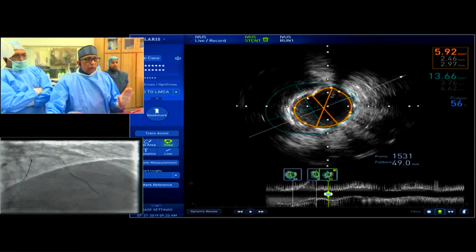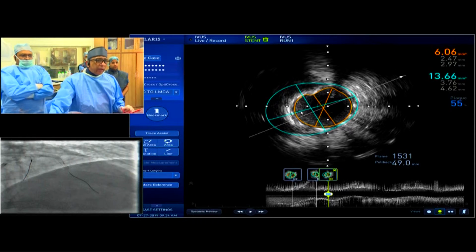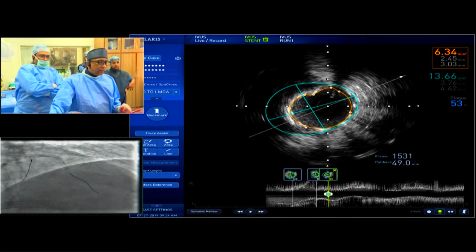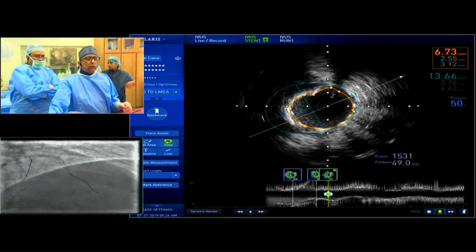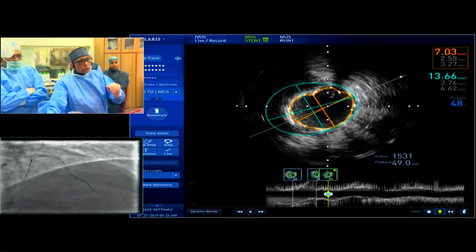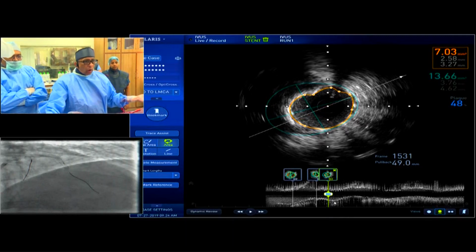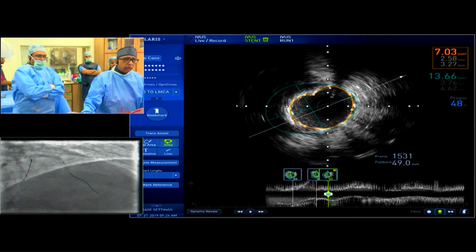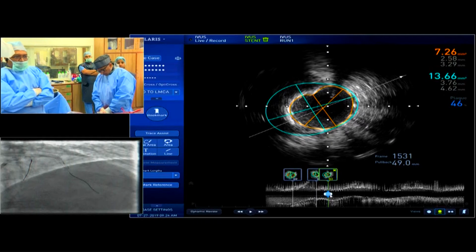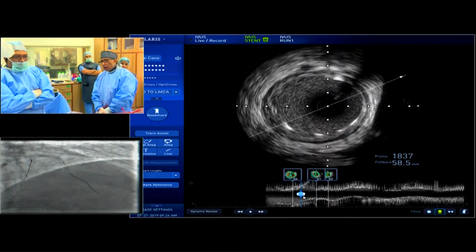Yeah. No. You cannot go up to 5. In a 3.5 millimeter stent, you go at least up to 4.5, not more than that. No, but it is an open cell design stent. I do not think they can guarantee you for the stent fractures and all. Okay, that's true, but the official limit is not more than 4.5. Don't you think you will come up later on with an ISR because it's already an under-expanded and malapposed stent? Don't you think?